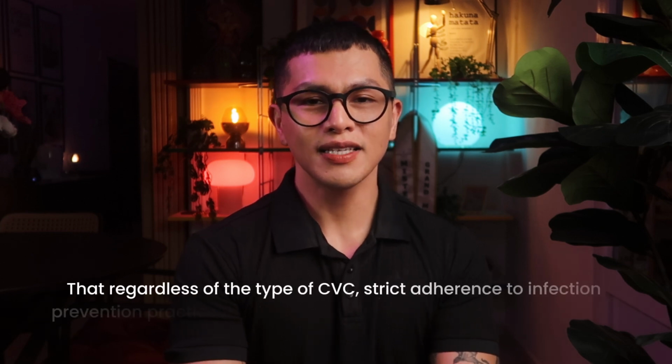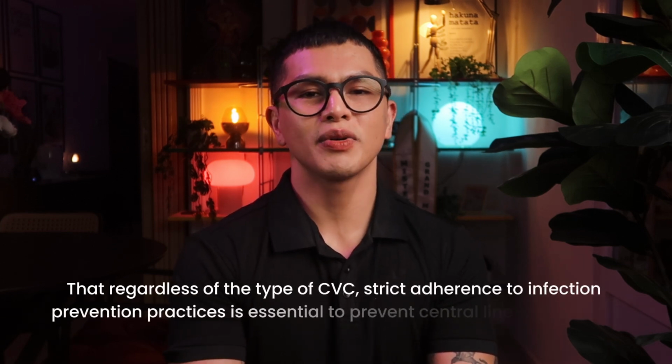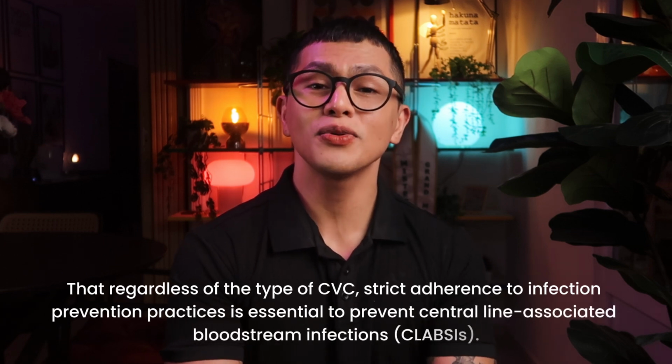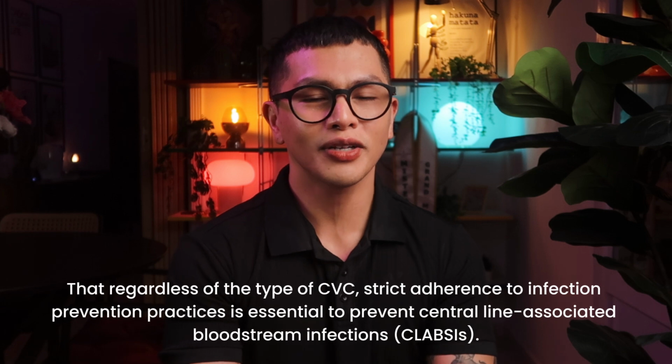Understanding the difference between these central venous access devices helps nurses provide appropriate care, prevent complications, and educate patients effectively. Remember that regardless of the type of CVC, strict adherence to infection prevention practices is essential to prevent central line-associated bloodstream infections, or CLABSIs.